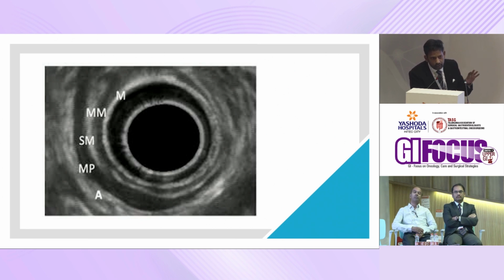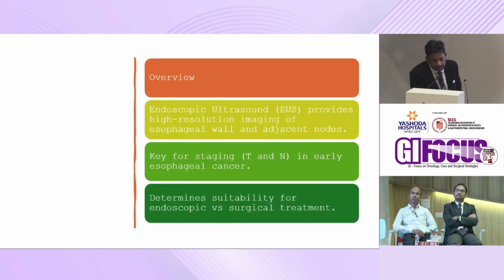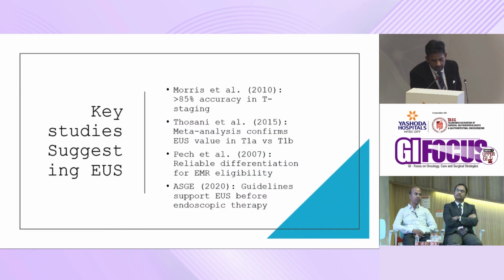So when surgeons are touching those patients, you say, can you give me the image? And then I will look at it, what it is. Because a PET CT might not be too relevant. By the time they come to you, they are coming for surgical ones. So you should not be attacking, and the size of the lesion and also the dysplastic images, you need to look at it. So I just skip all these things just for the sake of these ones.